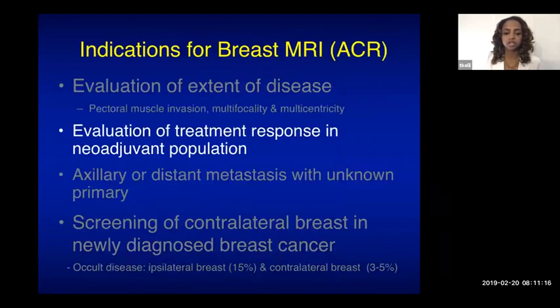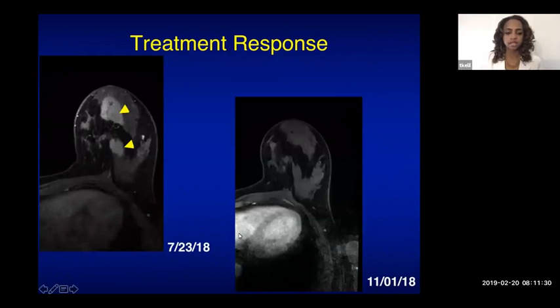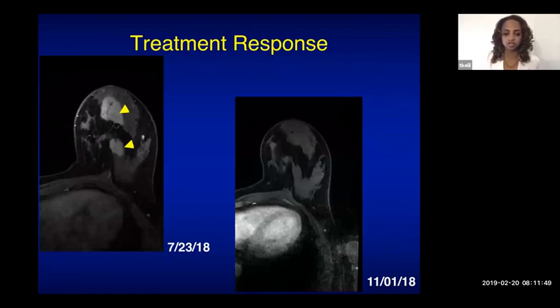MRI can evaluate treatment response in patients receiving neoadjuvant chemotherapy. For example, a patient with invasive ductal carcinoma showing two large enhancing masses had complete resolution of enhancement after a few months of chemotherapy, demonstrating response to treatment.